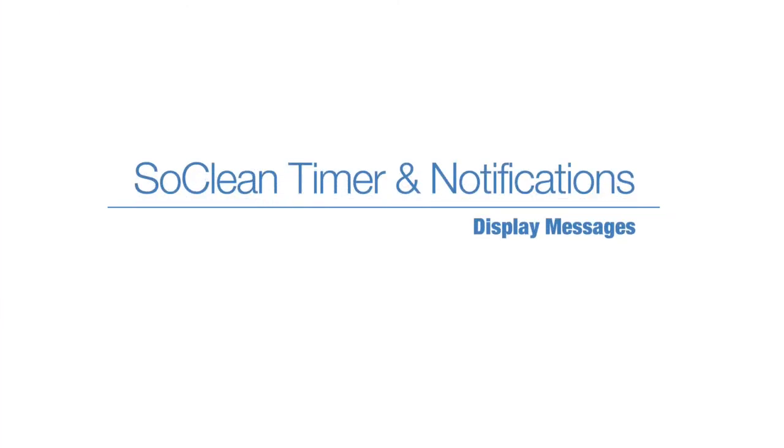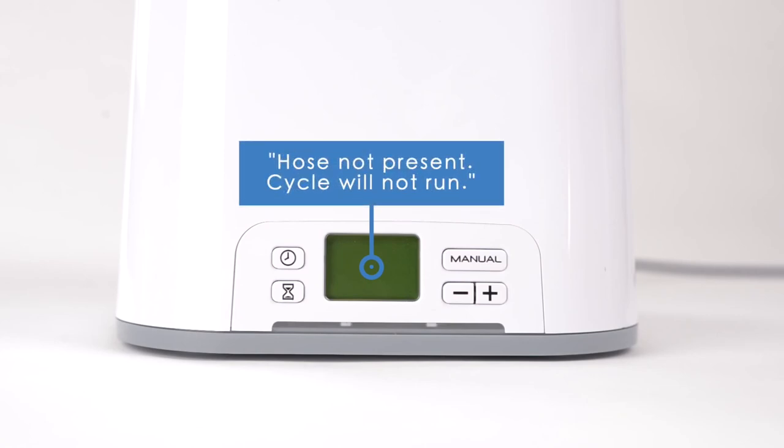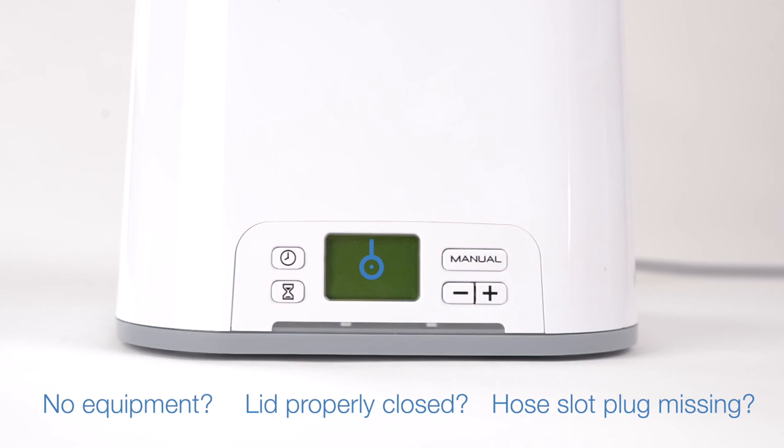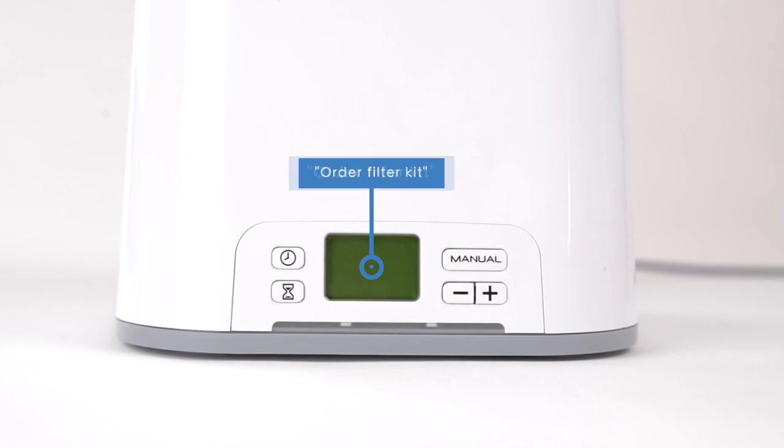Display messages: 'Hose not present — cycle will not run.' This message displays during manual mode when there is no equipment in the SoClean, the lid is not properly closed, or the hose slot plug is missing or improperly seated. If you've confirmed the equipment, lid, and hose slot plug are correctly in place and you still encounter this message, please contact SoClean for support. An 'Order filter kit' message displays after approximately 6 months of use as a reminder to order a replacement filter kit.